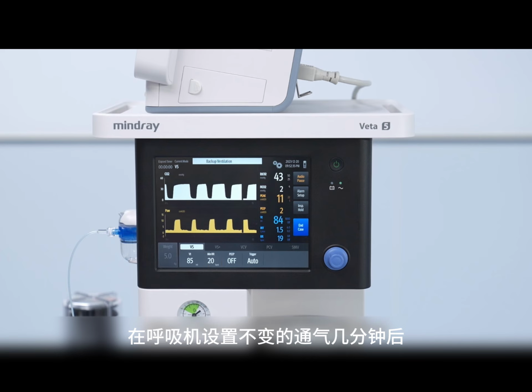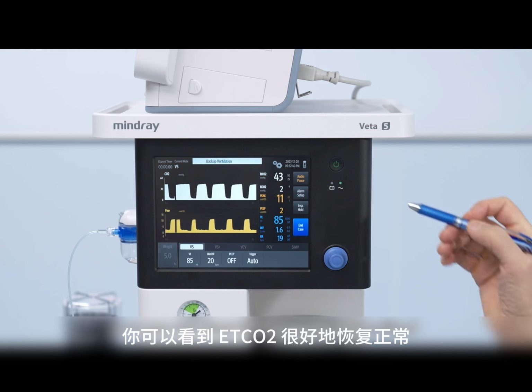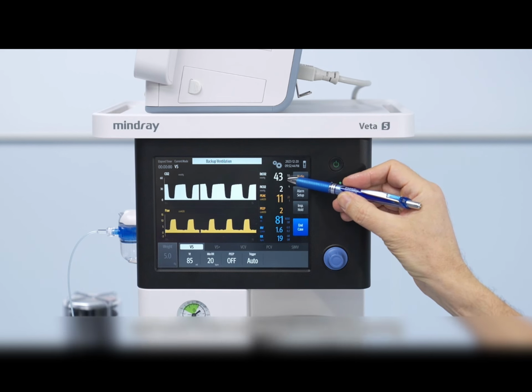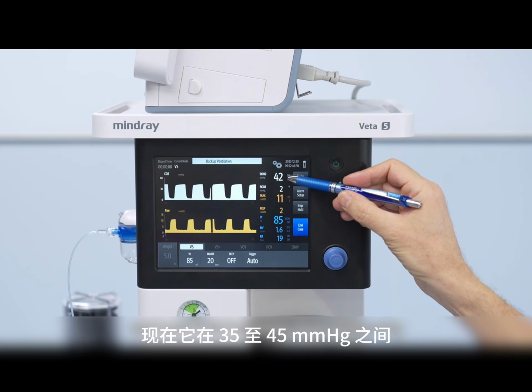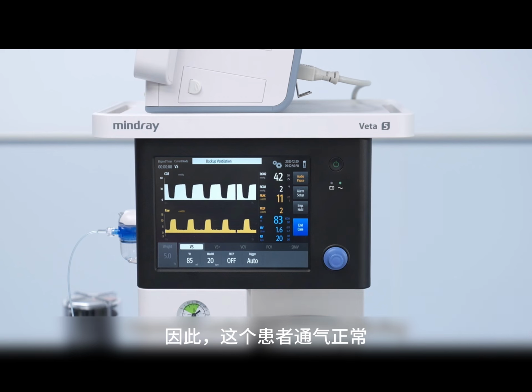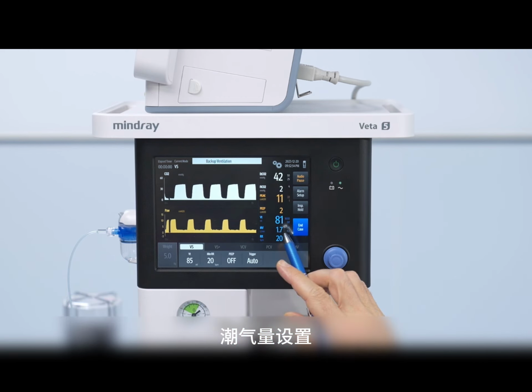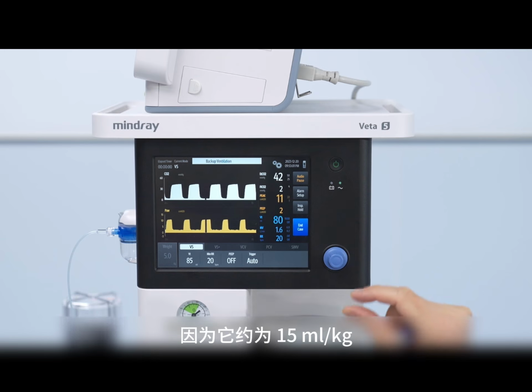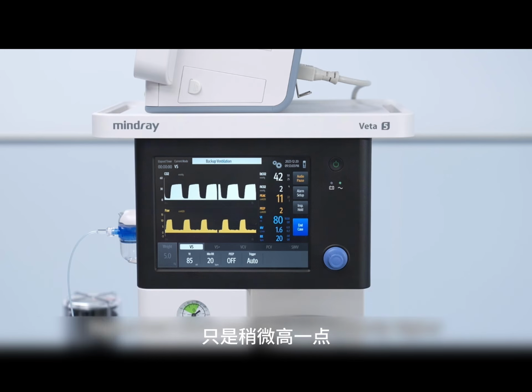After a few minutes of ventilation with unchanged ventilator settings, you can see that the end-tidal CO2 nicely normalized, and now it is between 35 to 45 millimeters of mercury. Hence, this patient is normoventilating. The tidal volume setting is more or less appropriate for this patient because it's about 15 milliliters per kilogram, only a tiny bit higher, but I don't consider it significantly higher.